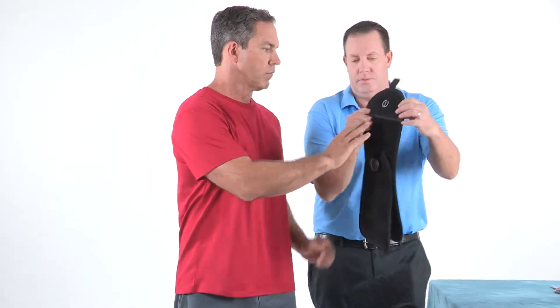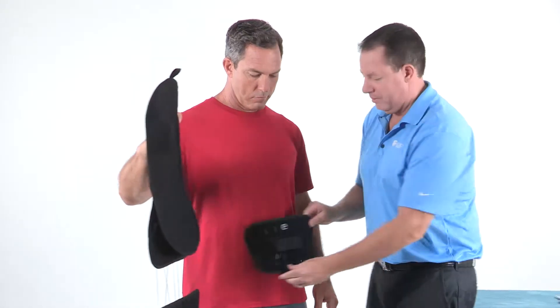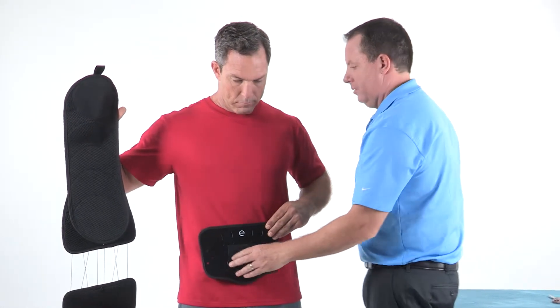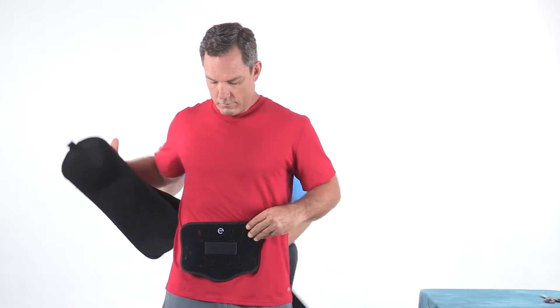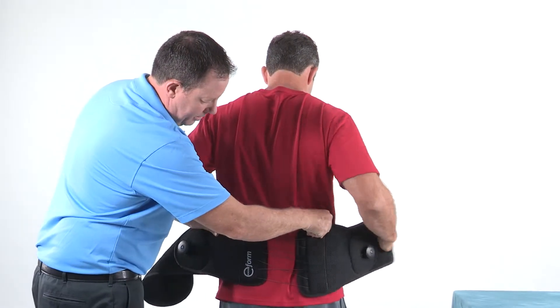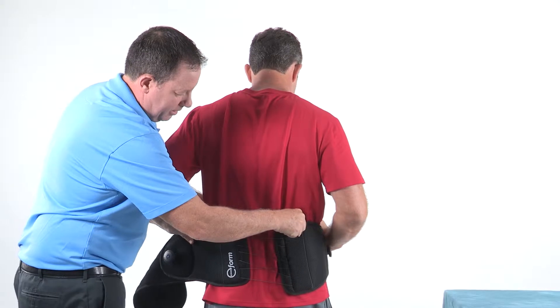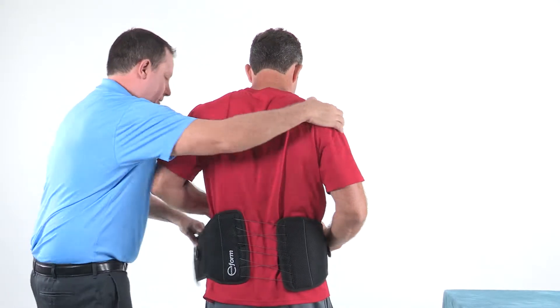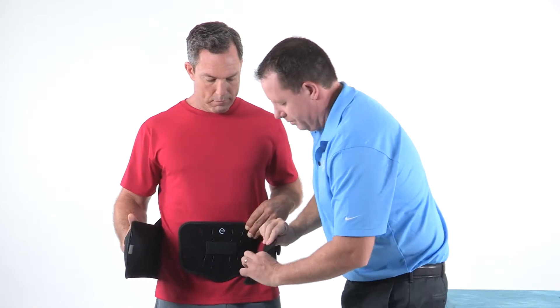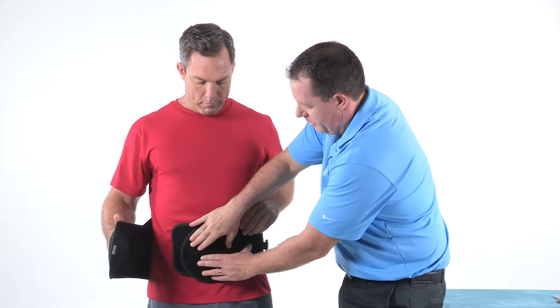To begin fitting the brace, have the patient slip their hand in the donning mitt to assist in holding the brace. Next, align the anterior panel on the front of the patient and have them use their opposite hand to assist in holding the anterior panel in position. Wrap the belt around the patient and center the lace opening along the patient's posterior midline, then continue wrapping the anterior belt wing around the patient. Ensure that the loop strip on the anterior panel is secured over the hook strip attached to the anterior panel.